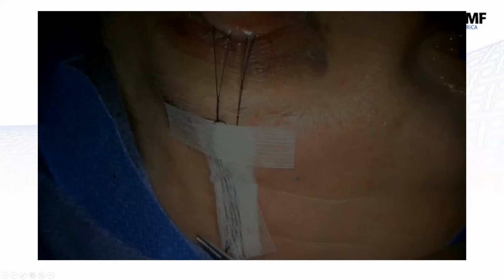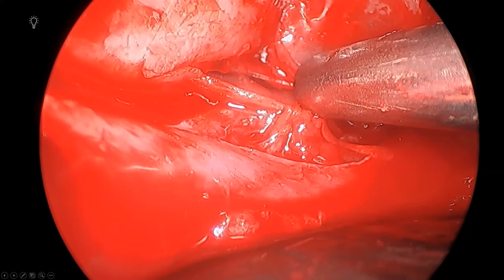Sal, could you comment on, so it's a nice endoscopic view there of the posterior shelf. Do you use any techniques to measure from the shelf to the orbital rim to help determine the length of the implant that you will use?